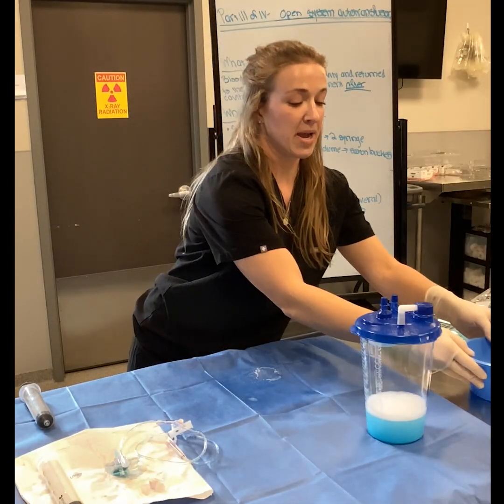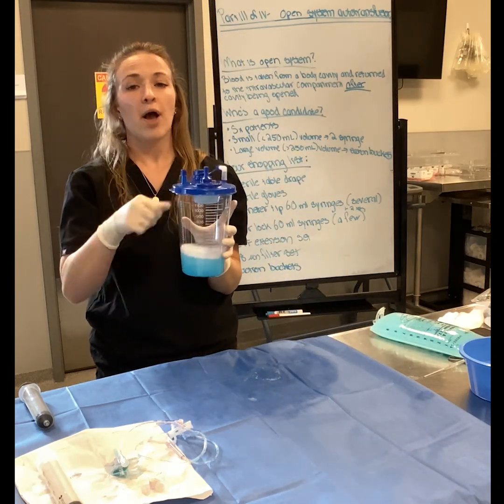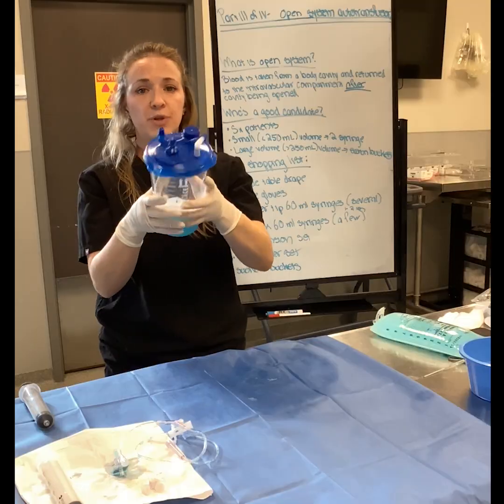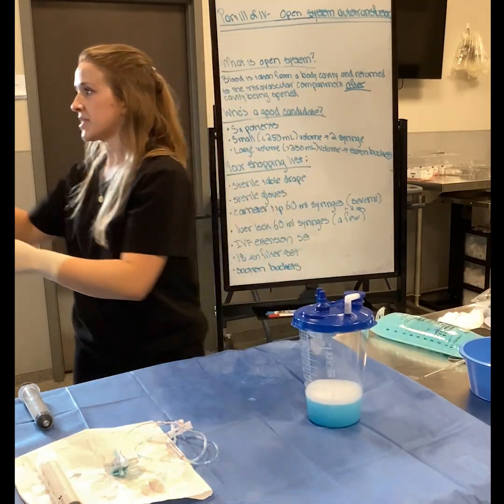So I'm going to move my patient's abdomen off the drape here. So we have a gassed bucket. I unwrapped it just prior to surgery. The surgeons got the blood in there, and I closed everything up just to try to keep contamination to a minimum, the very best that I can.